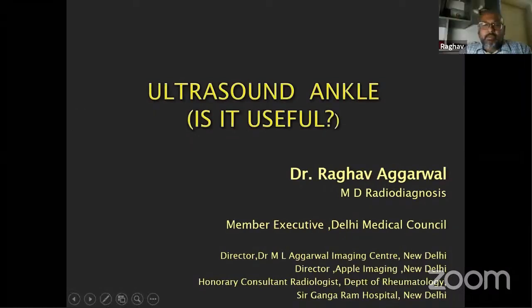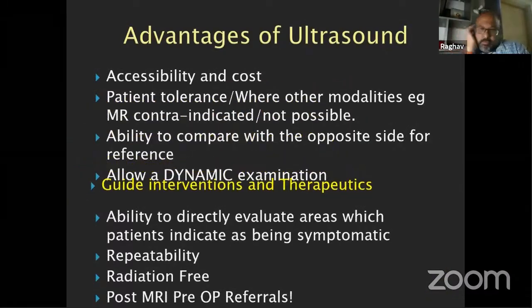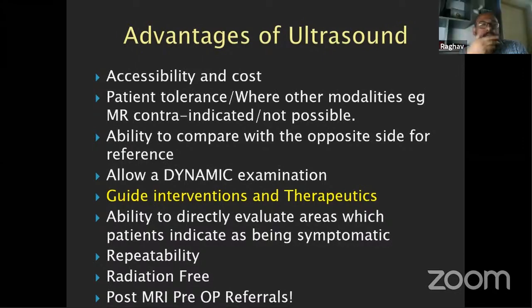My point is that I'll just talk a few things about ultrasound, the basic technique, and go ahead. Ultrasound is something like vodka: you can have it neat, you can have it with lime juice, you can put it in a cocktail. It will fit in everywhere, as a standalone modality or as an adjunct, where you have the X-ray or where you don't have the X-ray. There are obvious advantages of ultrasound technology: the cost factor, the patient tolerance. We can do the ultrasound on field, we can do it in the emergency room, and we can do what we call a dynamic examination.